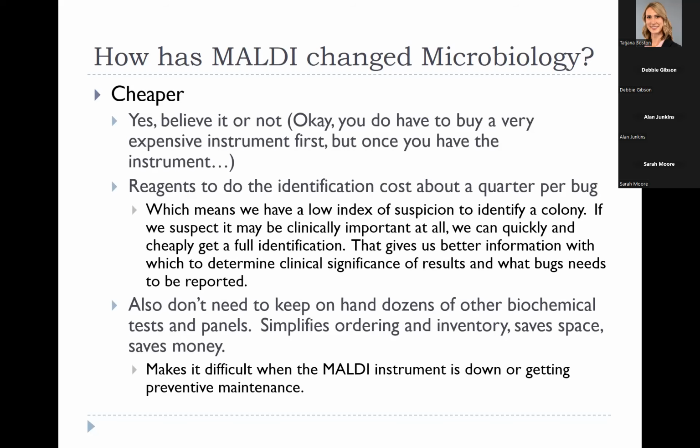Hey, Alan, it's Sarah. I think we've talked about this a little while ago, but I wanted to ask you again about any possibility that we're considering direct from blood MALDI testing in the future. I am definitely thinking about it.